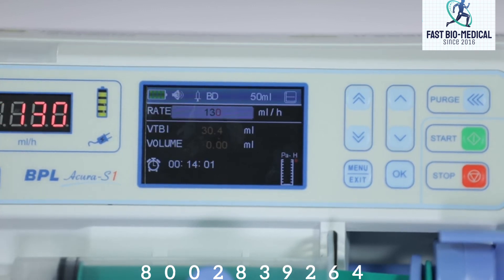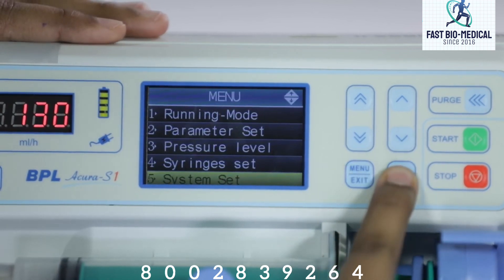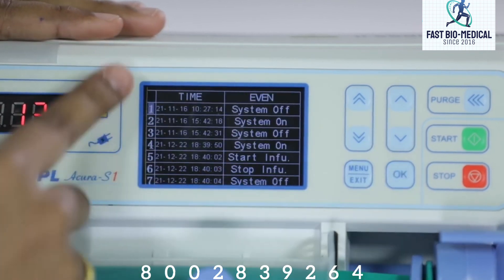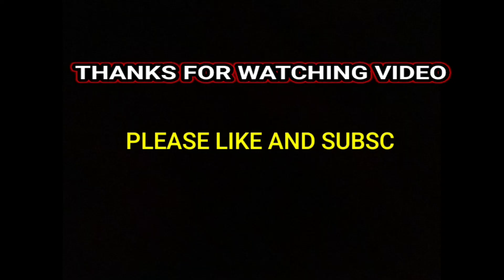The pump saves up to 2000 events. To check these log details, enter the menu interface, select system set, and press OK to enter the log. You can use the keys to view the log details.